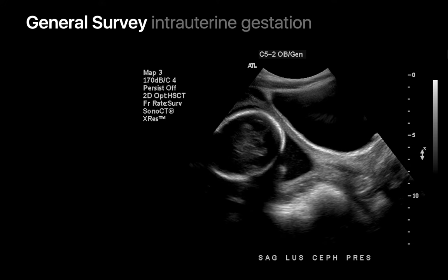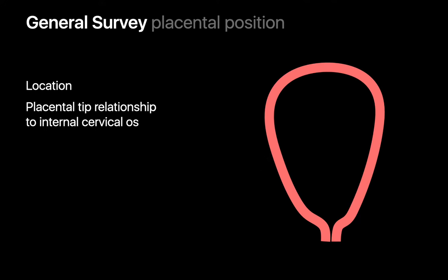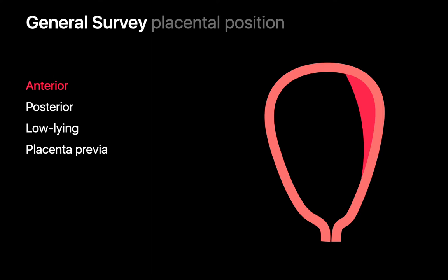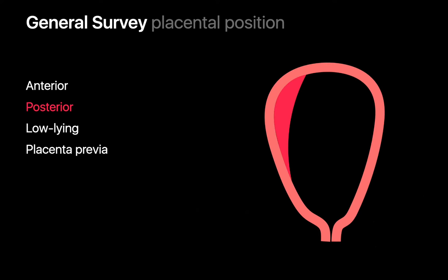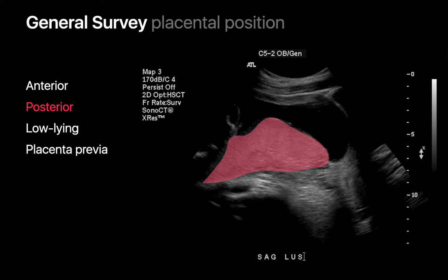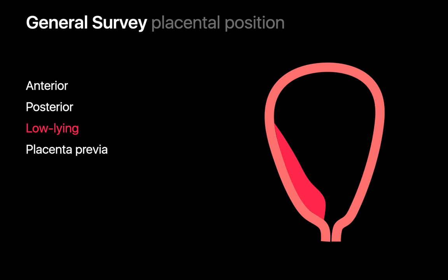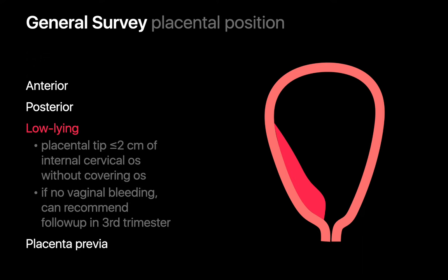We then turn our attention to the contents of the gravid uterus, beginning with the placenta. We identify the location of the placenta and check how close its inferior tip approaches the internal cervical os. Placentas can be anterior or posterior in location. Some placentas are low-lying, meaning the placental tip approaches but does not cover the internal cervical os. We describe a placenta as low-lying if its tip encroaches within two centimeters of the internal cervical os.